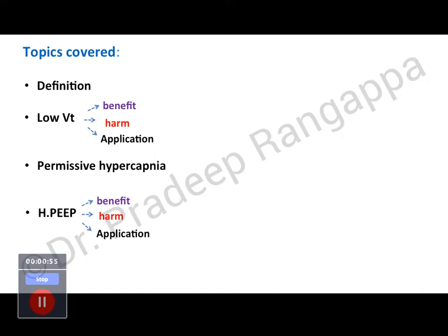The second pillar is high PEEP. PEEP is positive end expiratory pressure, and these are the two important elements which we need to tweak to optimize ventilation in ARDS. For PEEP, you need to understand the benefit, harm, and how we apply PEEP. And the third important thing is recruitment. Recruitment is when your strategy of low tidal volume or high PEEP is not achieving your desired oxygen saturation in a patient, then we have to consider something called recruitment.